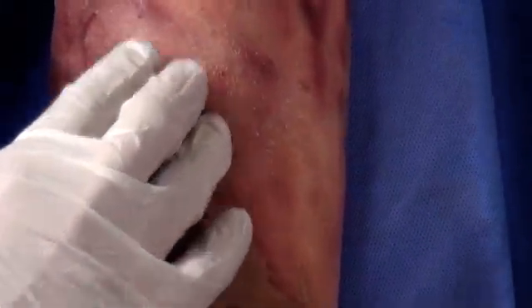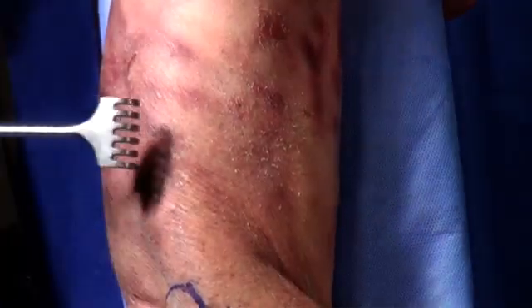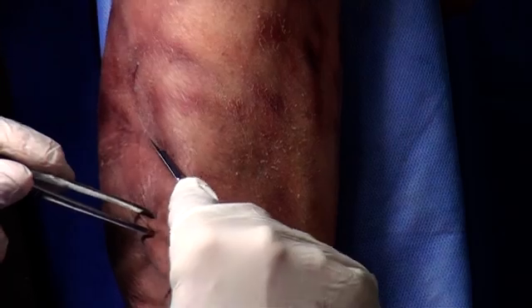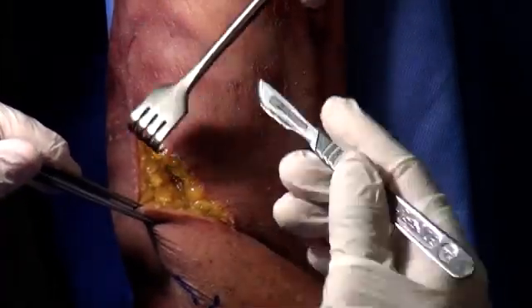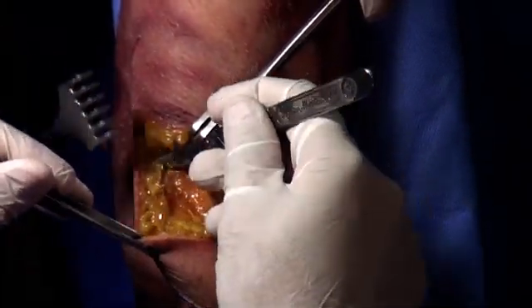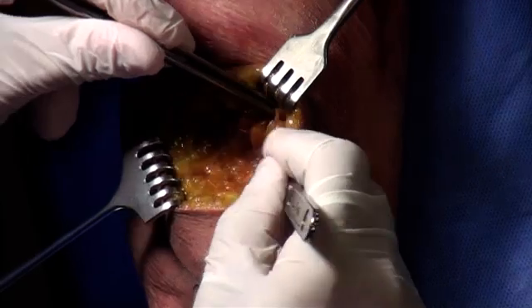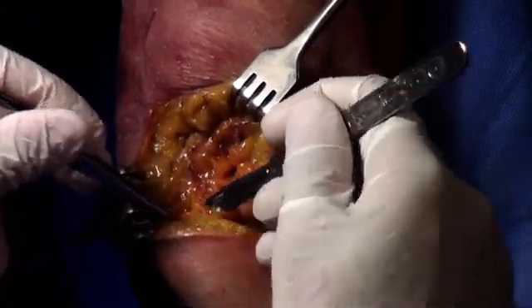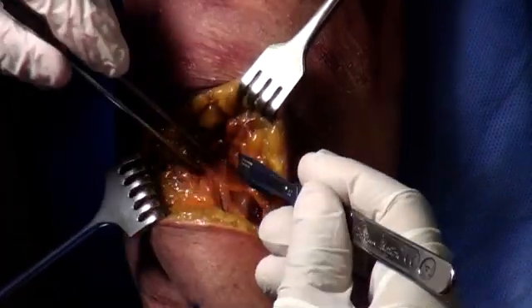You need to feel this area — I can feel the biceps and the brachialis and feel where the groove is in between. We're going to do an oblique incision. I feel the space in between the biceps and the brachialis to guide the cut.